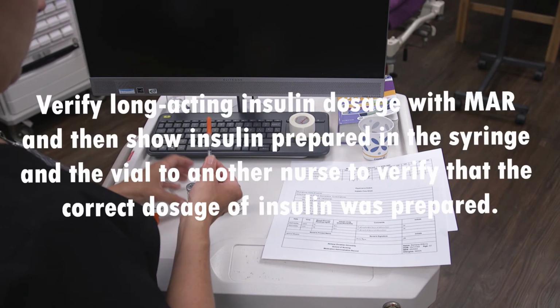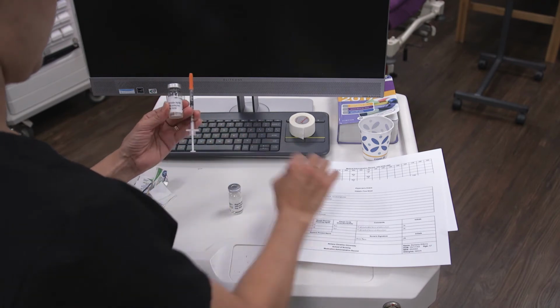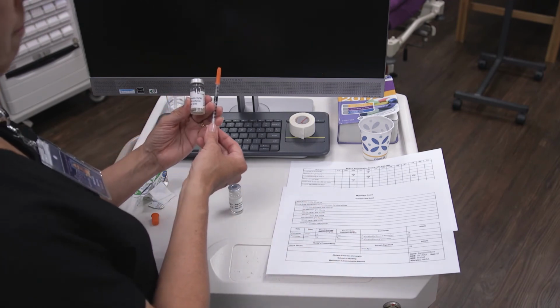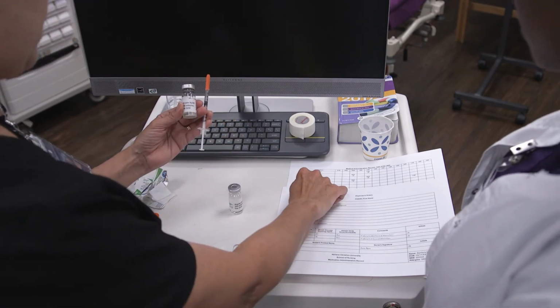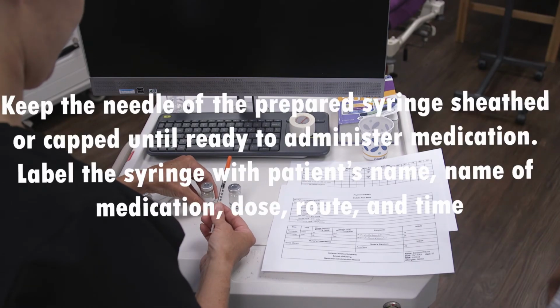Verify long-acting insulin dosage with MAR and then show insulin prepared in the syringe and the vial to another nurse to verify that the correct dosage of insulin was prepared. Keep the needle of the prepared syringe sheathed or capped until ready to administer medication.